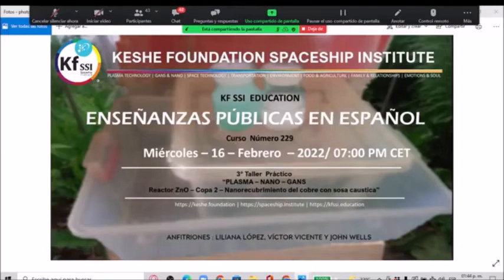Sí, y hemos visto que también hemos nanocubierto el plástico que se utiliza para las prótesis, la cerámica. We've also nano-coated the plastics and ceramics that are used in the dental works.